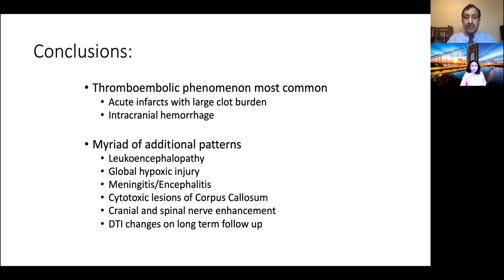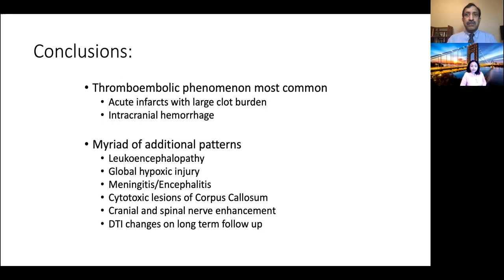Intracranial hemorrhage was also fairly common. In addition, we saw additional patterns including leukoencephalopathy, diffuse leukoencephalopathy of hypoxia, global hypoxic injury, meningitis and encephalitis, cytotoxic lesions of the corpus callosum, olfactory bulb lesions with T2 hyperintensity and enhancement, cranial nerve enhancement, enhancement of the spinal nerves related to Guillain-Barré, and DTI changes described in a single paper reflecting microstructural damage related to COVID-19, which will need additional follow-up studies.